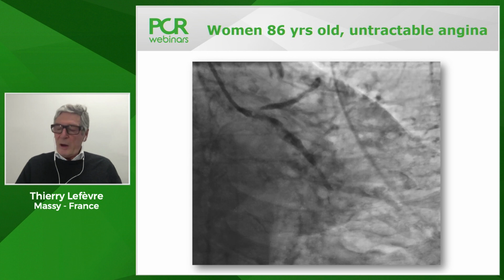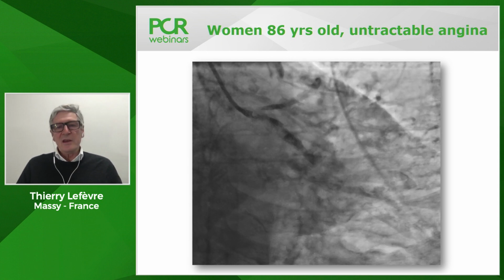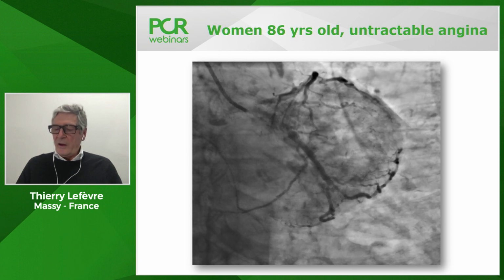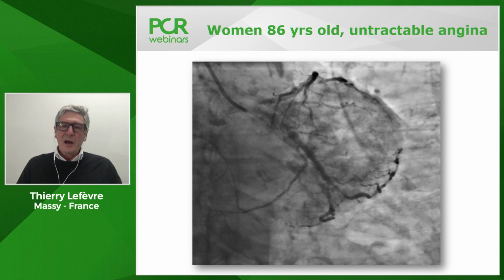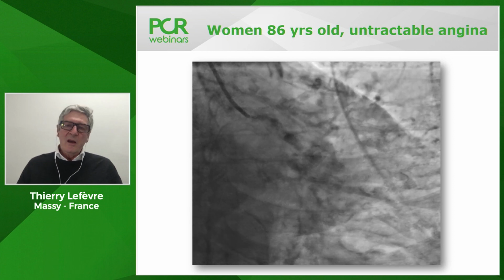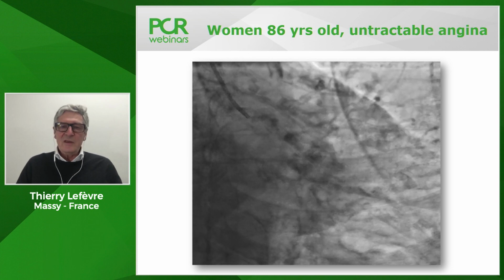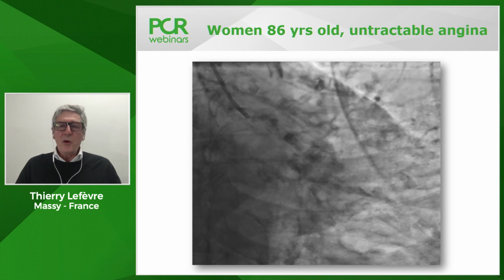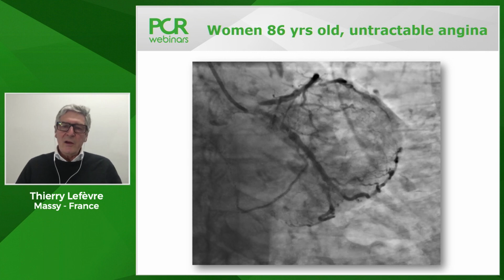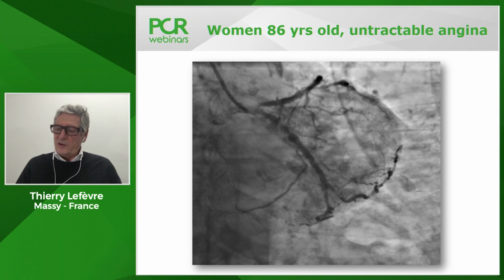Now the coronary angiogram was done the day after the admission. She had severe recurrence of chest pain during the first 24 hours. And you can see that there is calcification, severe distal left main disease with a short lesion of the proximal LAD and a long lesion, very irregular, of the circ, which is the big territory.